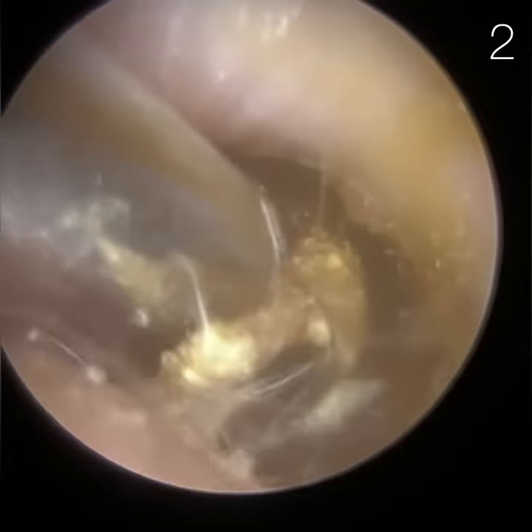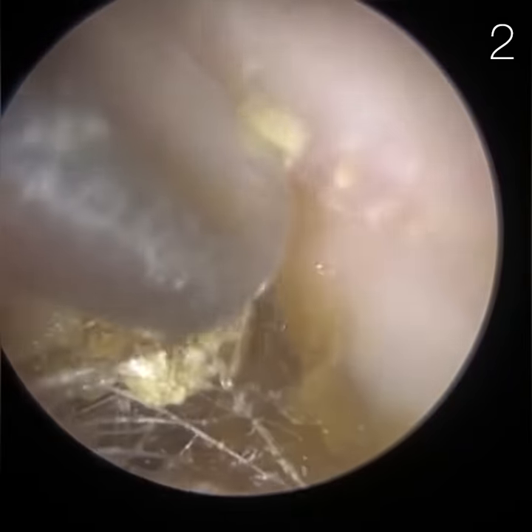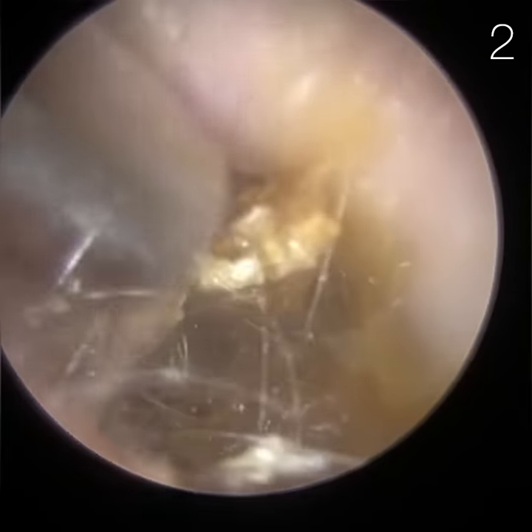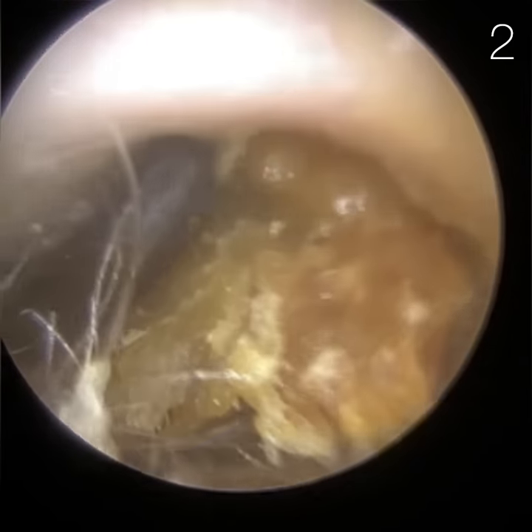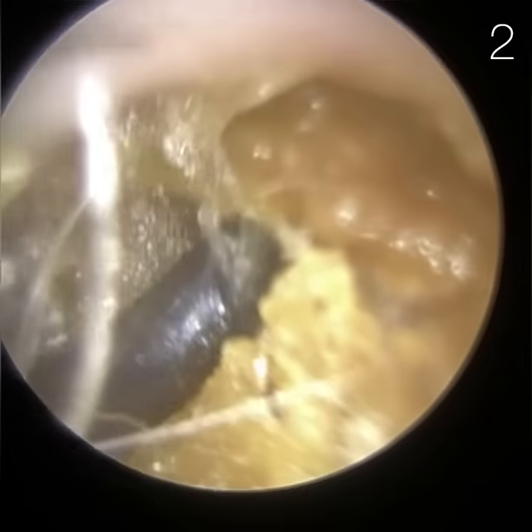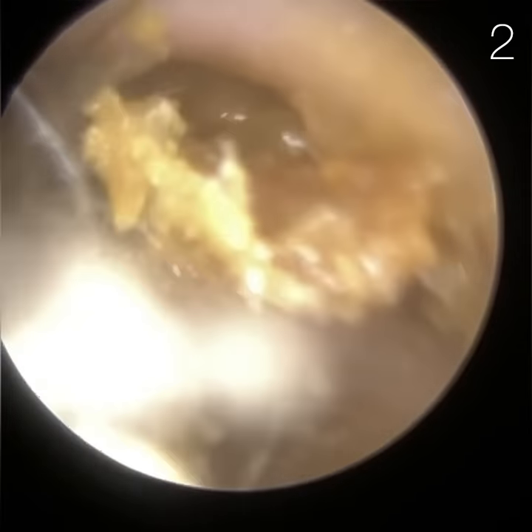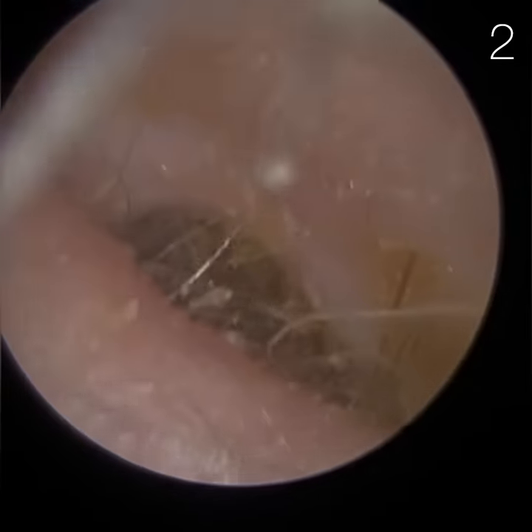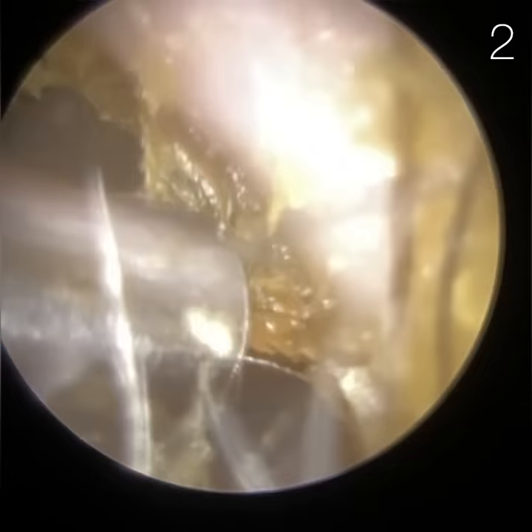And this is patient two. They've got a bit more of a tight and narrow ear canal entrance, so I'm just trying to tease this out and separate it from the roof of the ear canal. It's quite impacted here. The reason why we're so close to the wax is because the wax is near the entrance, so the endoscope is having to be quite close to enter the ear, and when the wax is closer near the entrance it's going to appear zoomed in. I'm just using the St. Bart's ear hook, trying to get in at the top of the ear canal, but it's a bit of a tight squeeze. Here I'm just chiseling it into little pieces, then going in with the endoscope to vacuum some of the loose pieces.